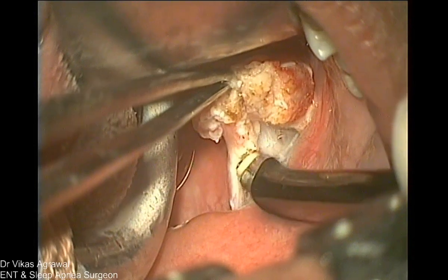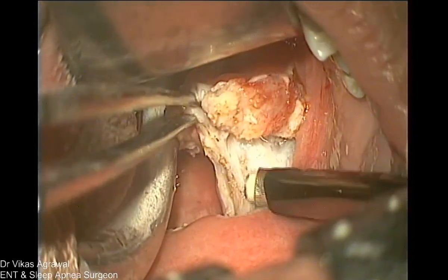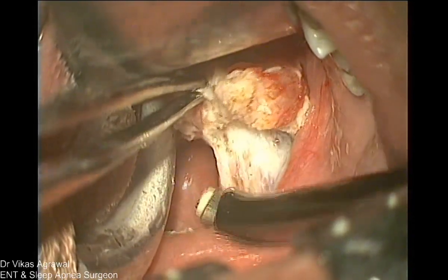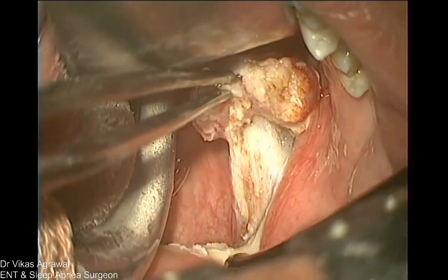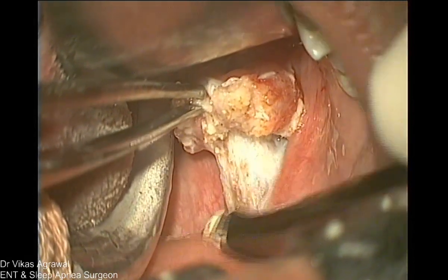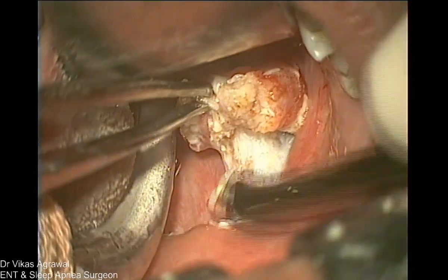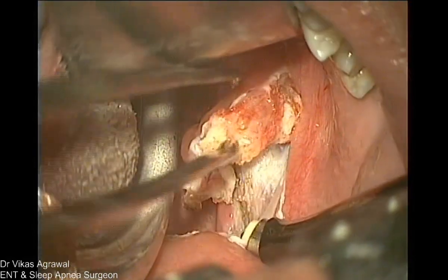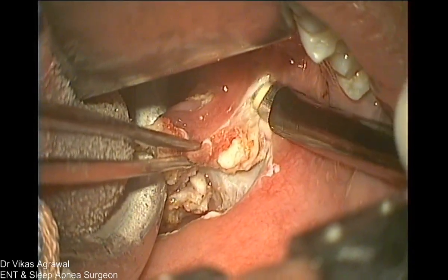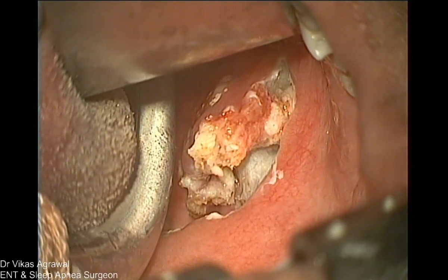So see, I'm removing it here. I'm not removing the vertical part. Vertical part is this. And since this angle is 90 degree, can you see this? This angle is absolutely 90 degree. So it will close like this. But the fibrosis in the vertical part is going to happen vertically. It's not going to happen like this. So this will never ever cause a velopharyngeal stenosis. And if you use cautery to do the same, you may still get a stenosis. Sure, because there will be a lot of charring.